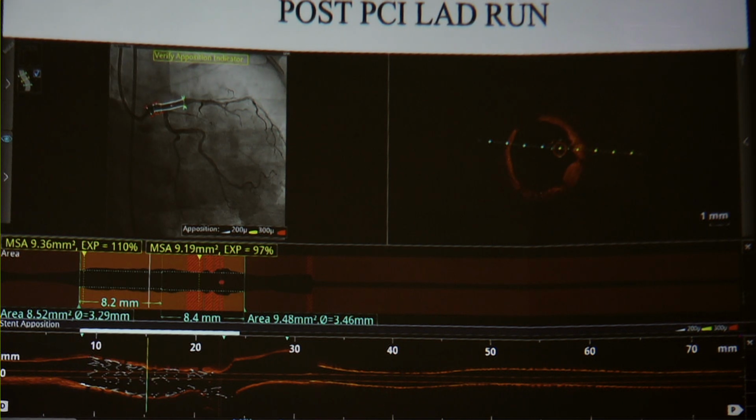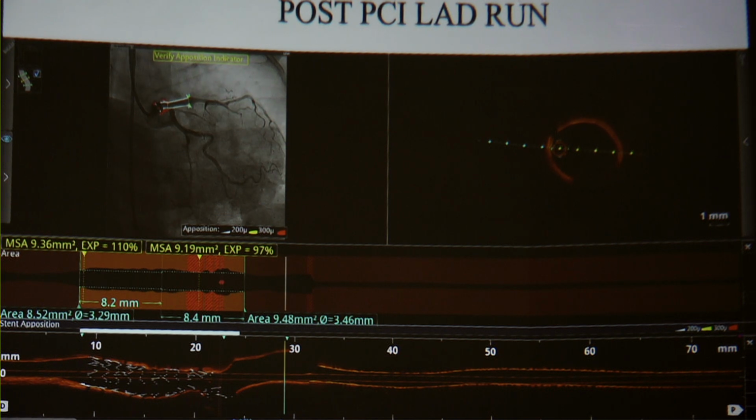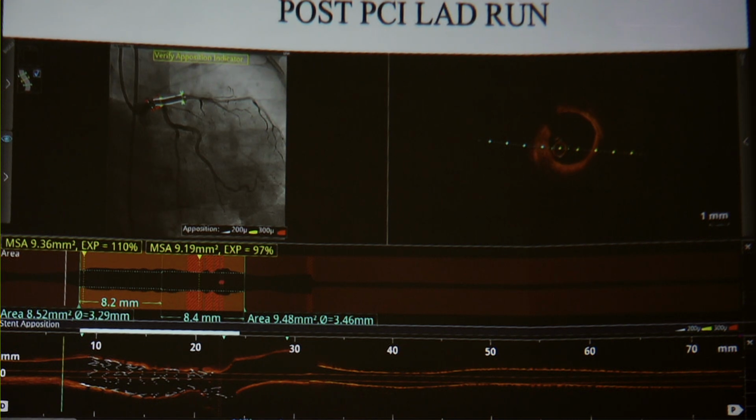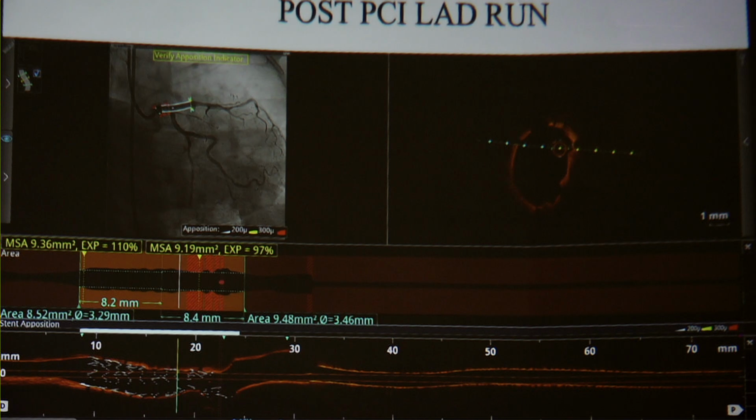First message, in this kind of case, as Dr. Tejas Patel said, never try to nail the ostium, number one. Number two, use imaging appropriately. Now we know that there is a shift of hematoma. We analyzed this case for a good 10 minutes. We saw each and every frame here. We found that there is hematoma in the left main, but that is not communicating with the lumen. So either we go left main to LAD, putting a double layer jacket here.